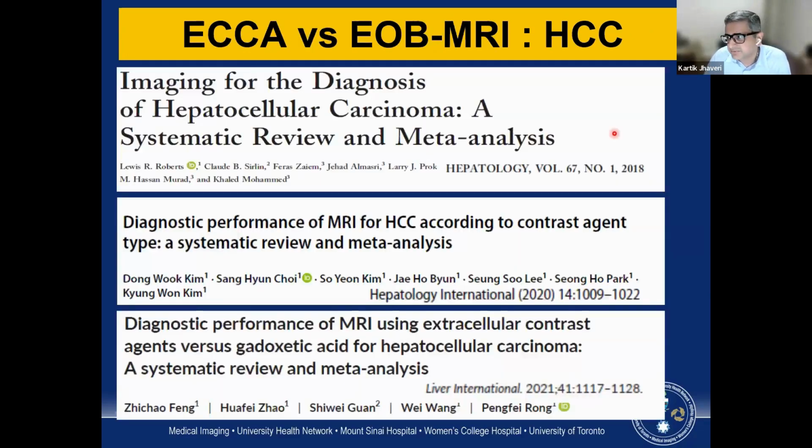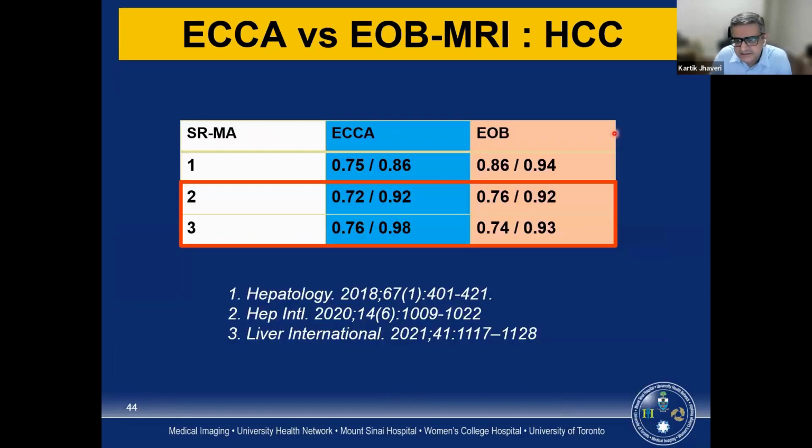So how does Primovist or Eovist MR compare against extracellular contrast agents? And these are three systematic reviews and meta-analyses from the literature that I just want to present here and summarize.